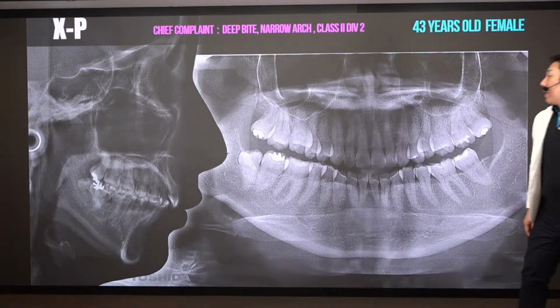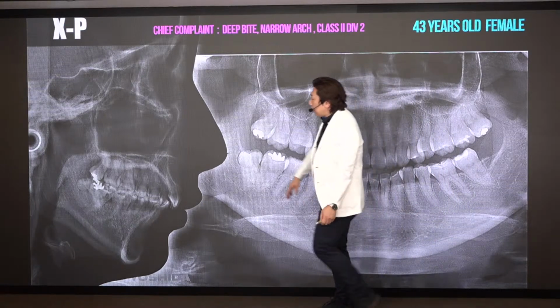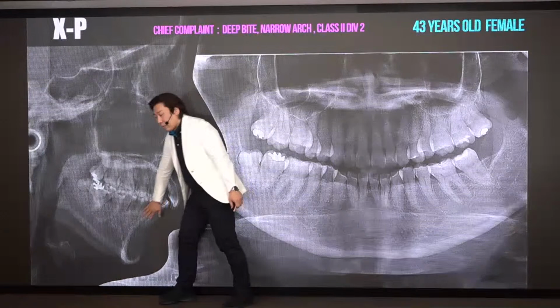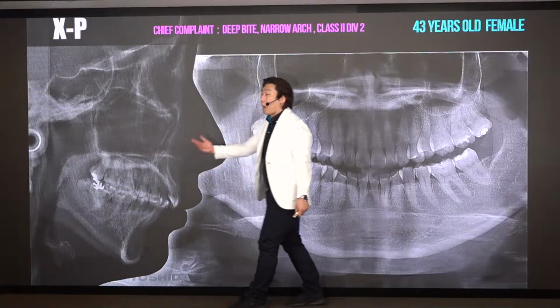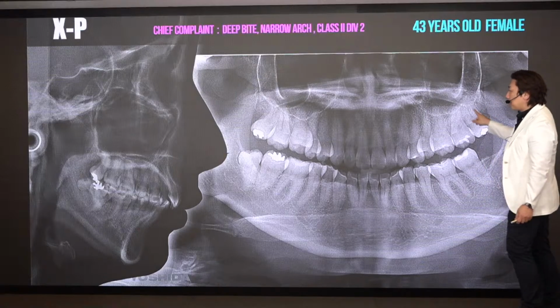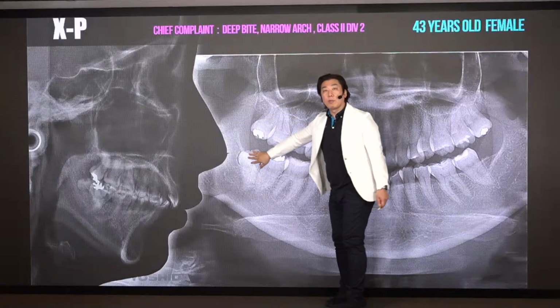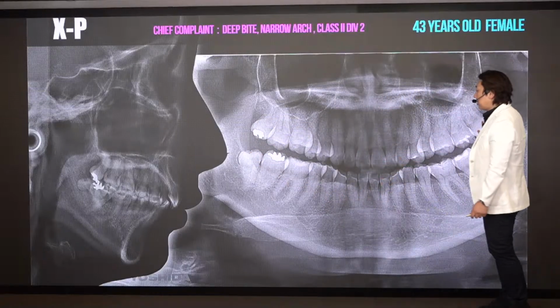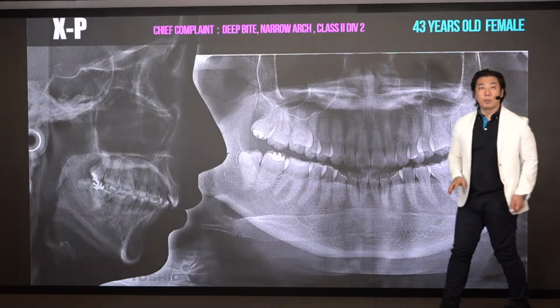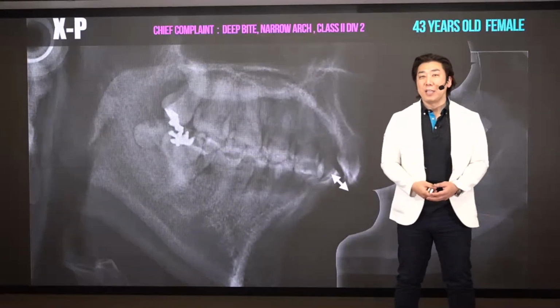Okay. This is the X-ray. As you can see, the mandible is just a little bit shifted to the back. And this is a panoramic X-ray. Here is a wisdom tooth. My planning is extraction of the wisdom tooth here. And check the condyle position too, on MRI and sometimes CT.